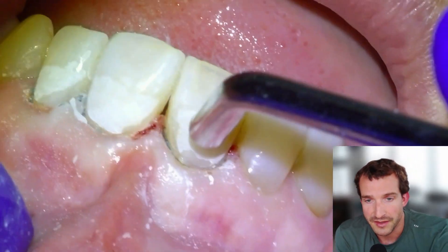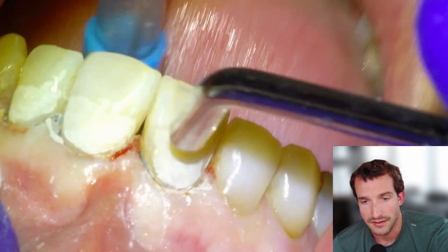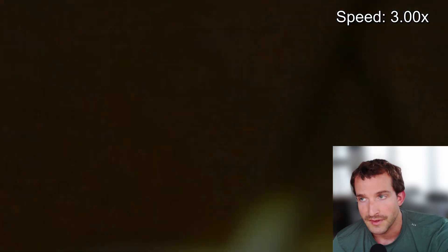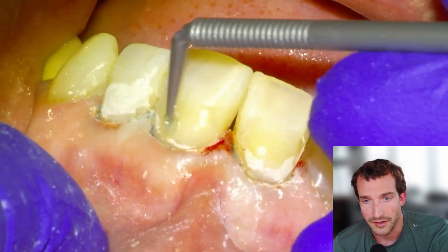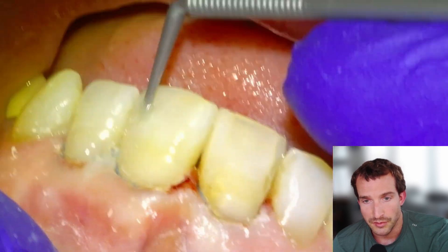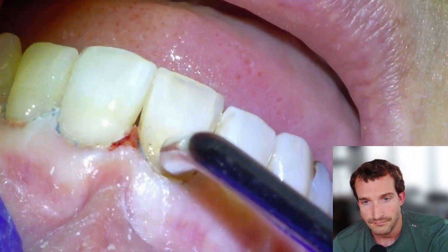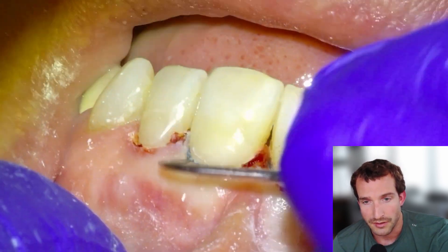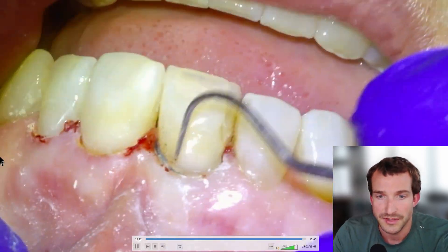I'll make a note about the before and after photo once we get to the final screen. Just going to fast forward through the rest of the footage. We're going to coat with an unfilled resin bonding agent before removing the cord. Jackie's going to cure that — sometimes I'll air thin it — and then we'll remove all of the cord, and that's pretty much it.